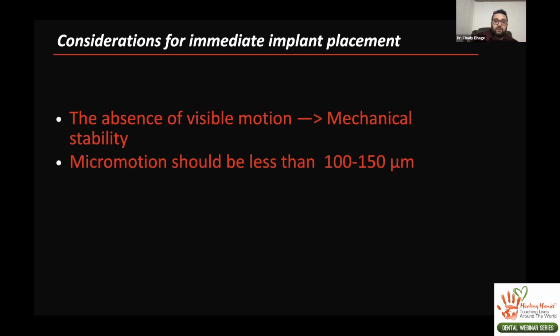So when we're talking about placing an implant, what we're looking for really is primary stability. We're usually looking at torque values of anywhere from about 25 to 35 newton centimeters and above. Most of our patients that we're immediately loading are usually in the 50, 55 and above range. For example, an all-on-four patient, if you're placing 4 to 6 implants, they may not all torque in at 50, 55 newtons. You may have one or two implants that torque in at 10, 15, 25 newtons, just because it might be an area where there's soft bone. We'll still load because the majority of our implants have torqued in well.